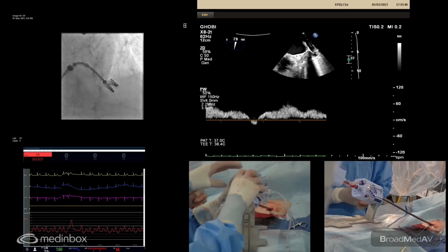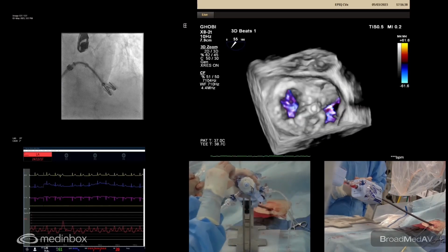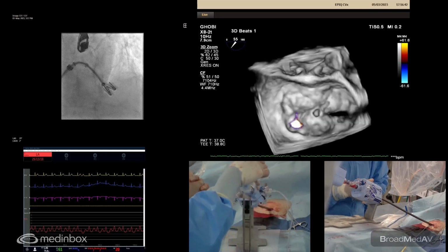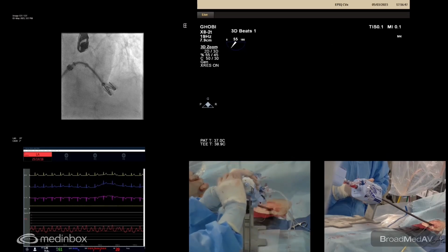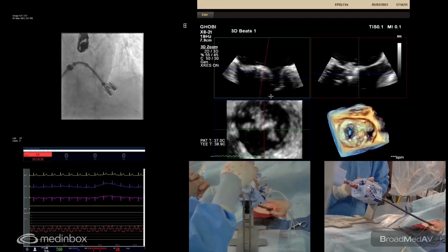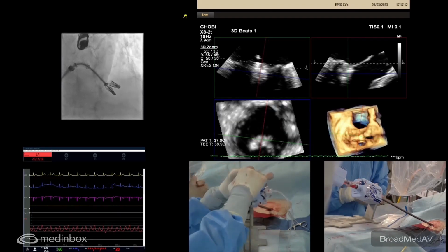So you want to try tighten it up. So you see the aorta is on the top, the mitral valve in the middle, left side is atrial appendage, right side is septum. That's just the lateral and medial. We still got just a small jet and the medial jet there. Still nice dual orifice, big jet, yes. Yes, go ahead. Very good.